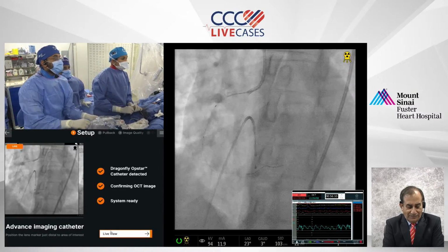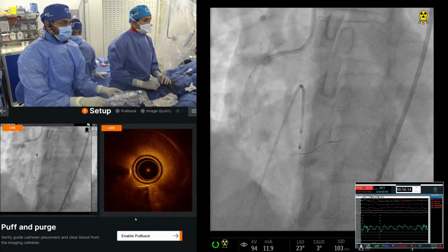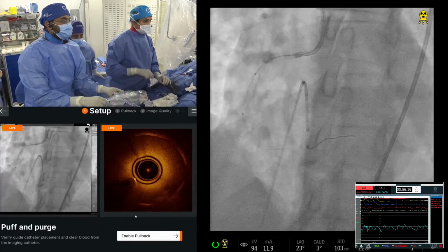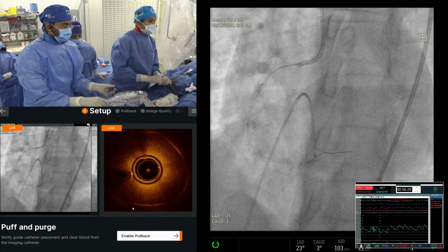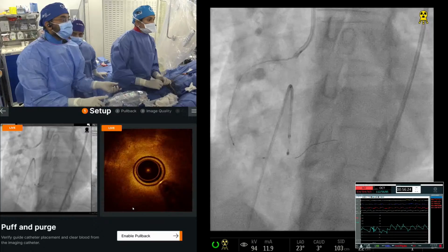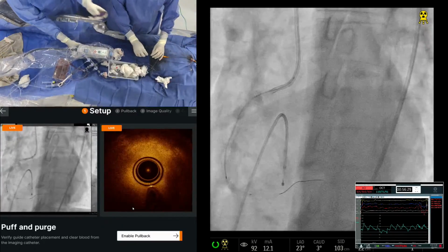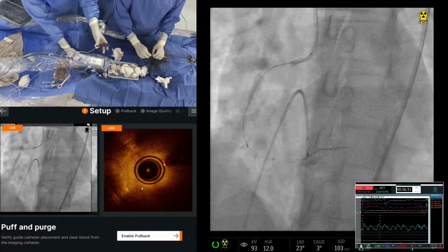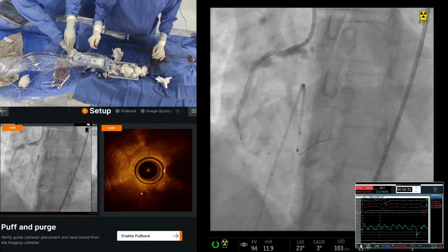I can tell you that I want to do a full revascularization in a young patient. If need be, I would not go with the distal RCA today, the way this patient has behaved. Let it recover, and I would do the functional test, a nuclear stress test. At that time we decide, because the circumflex also has very diffuse disease. Then bring him back for the third stage, RCA plus or minus circumflex.